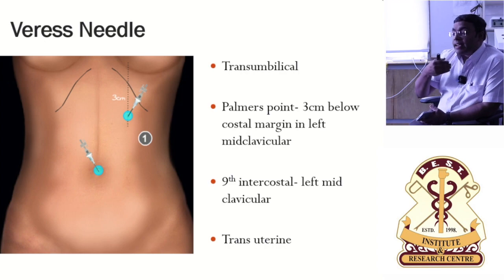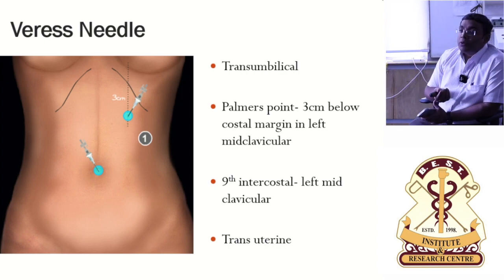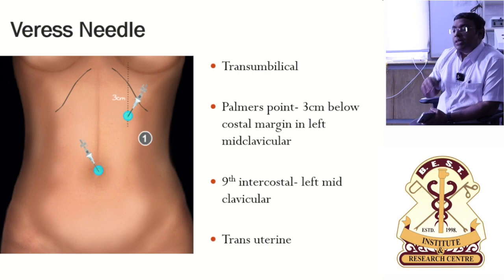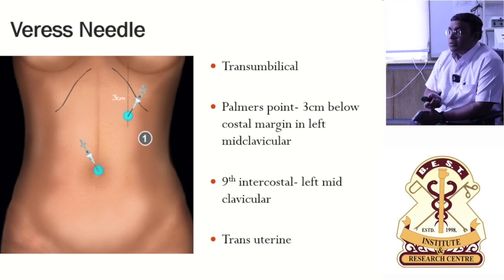Yes, you can access the pelvis, and you can access the upper abdomen also. Suppose the patient is having lap chole along with hysterectomy, so with one port at the umbilicus you can do the hysterectomy, and with the same port you can do cholecystectomy also.